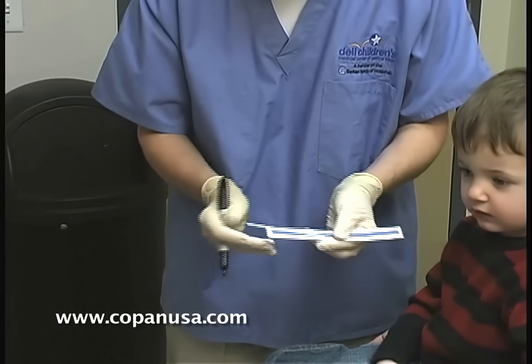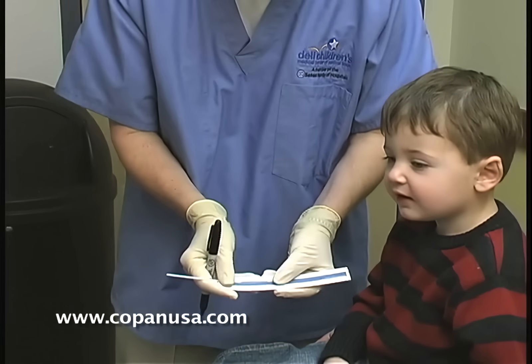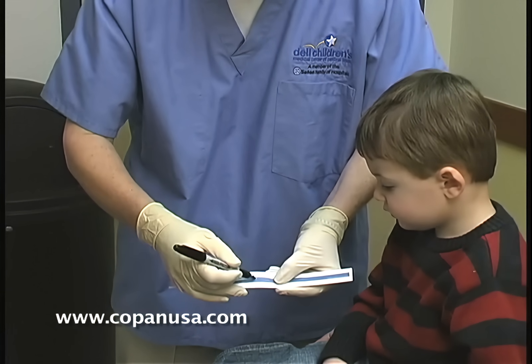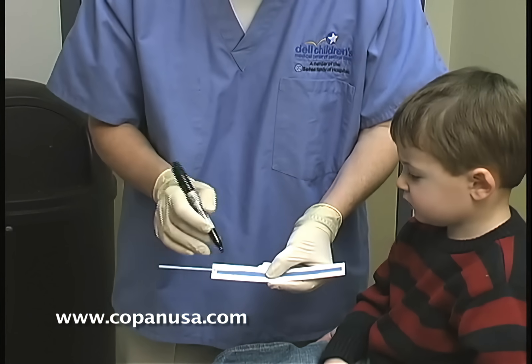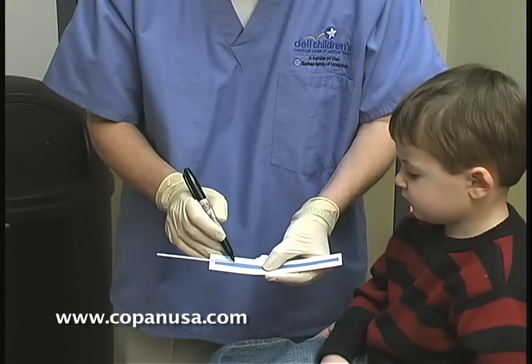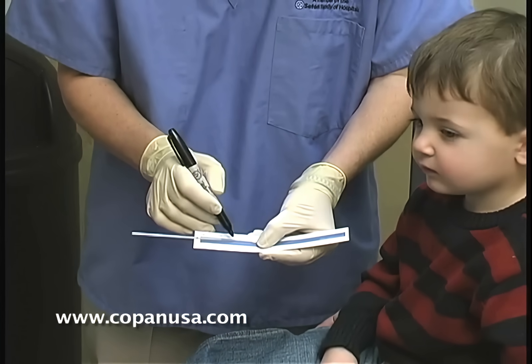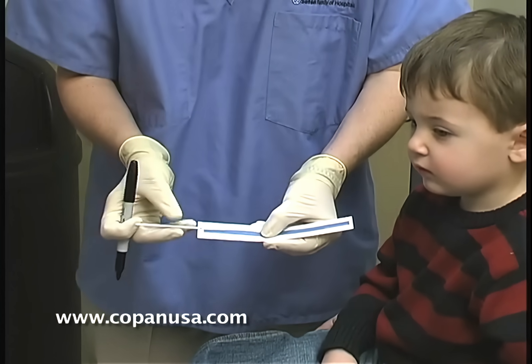You're going to take the swab, lay it at the seven centimeter mark, and mark it at three and a half — so half the distance, in this case three and a half. With our last patient, we went all the way up to the base to where the widening is on the NP swab. In this case, we're going about a centimeter and a half less because of the smaller size of the head.